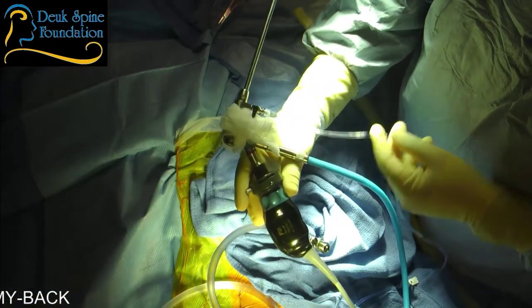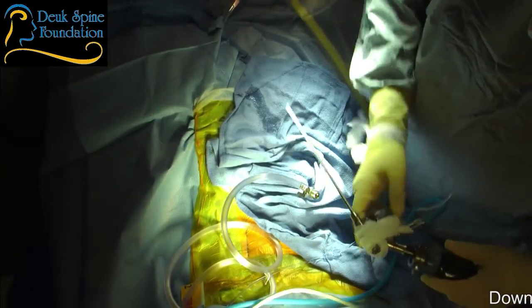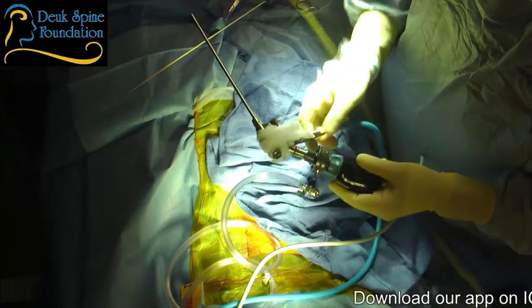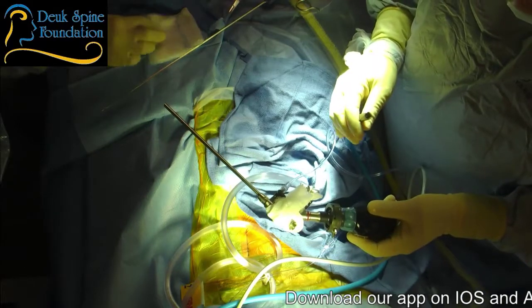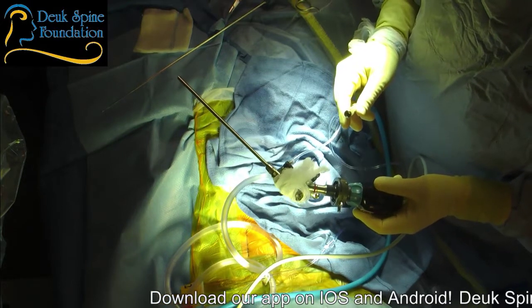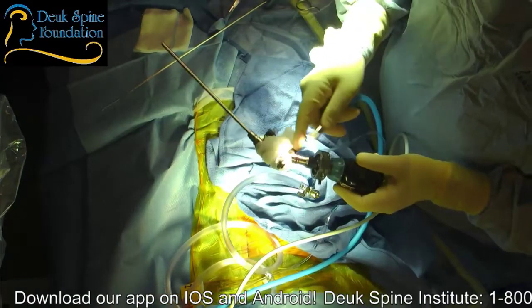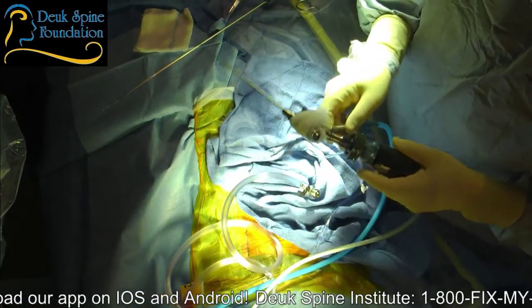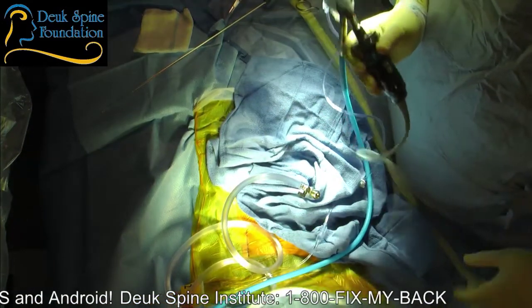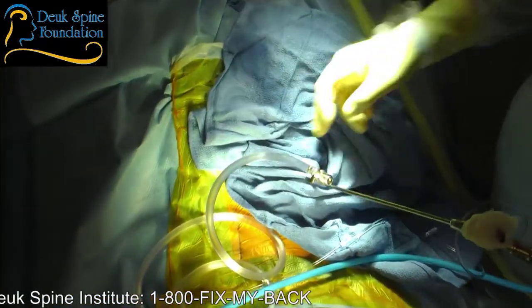All right, you got this tube, which is irrigation. The irrigation comes out the tip. See that? That removes blood and debris. This here is the light source. It's a fiber optic light source. Turn it on. Thank you. So you can see how bright it is. It sends light all the way down the scope to the end. And then you have the camera, which records the images and projects it onto a screen. And then we have the tube that we work through, okay? We have some suction here.